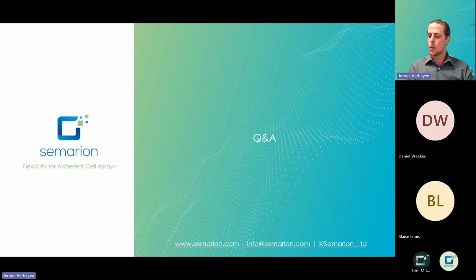Take maybe 2 more questions or so. One was quite related to what I said earlier about the neurites growing out of the SemaCyte microcarriers onto the surface of a well plate. There was a question on whether or not you can do migration assays with the microcarriers as well. That is possible. Something we haven't done ourselves internally, but anything like a migration assay or a scratch test type assay, we believe should be possible, again, by having the SemaCyte microcarriers face down on the well plate so that the cells can grow off the microcarriers.